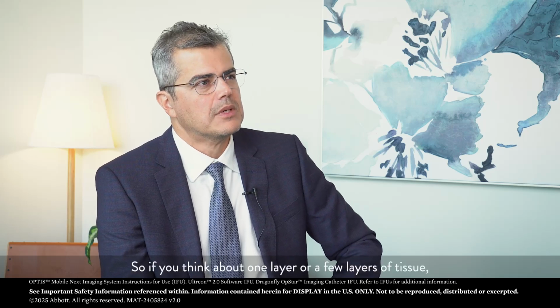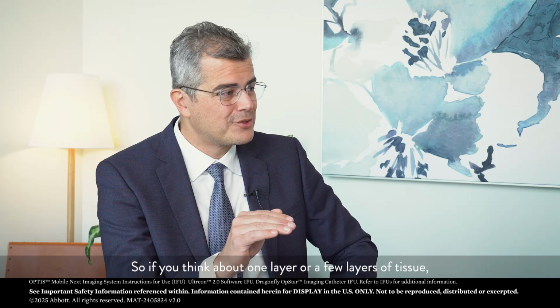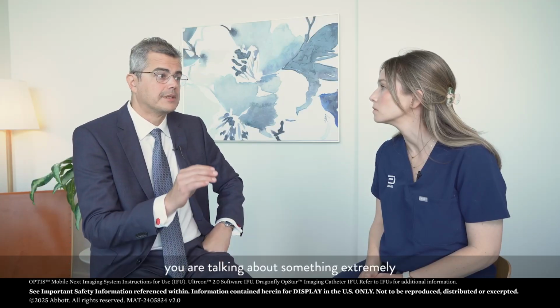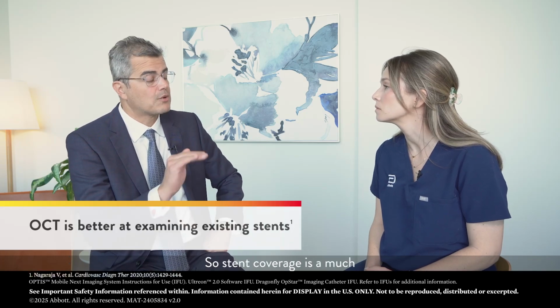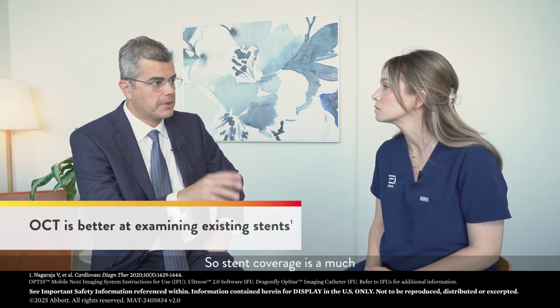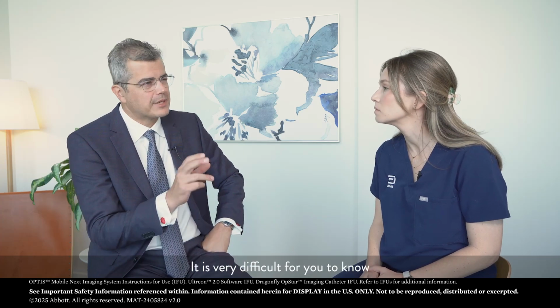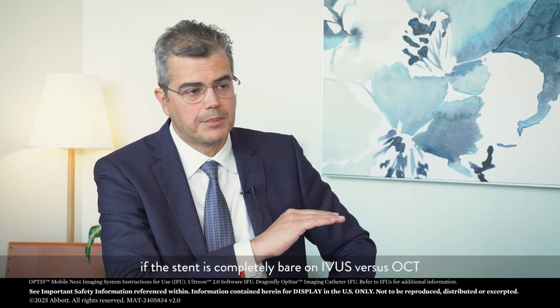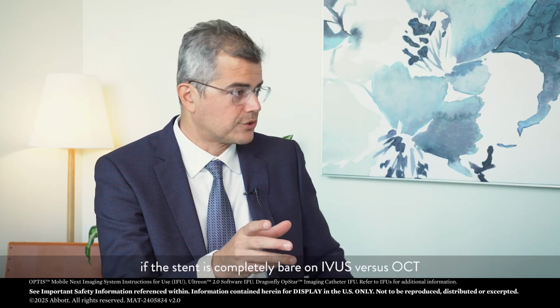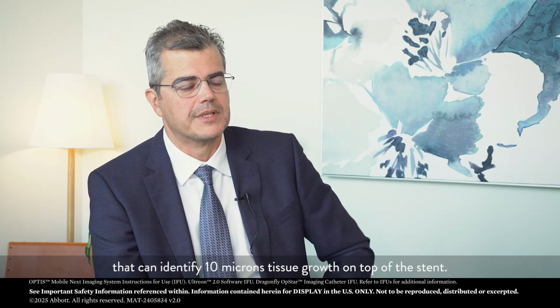If you think about one layer or a few layers of tissue, you are talking about something extremely thin in which axial resolution matters. So stent coverage is much better captured by OCT than IVUS. It's very difficult to know if the stent is completely bare on IVUS, versus OCT that can identify 10 microns of tissue growth on top of the stent.